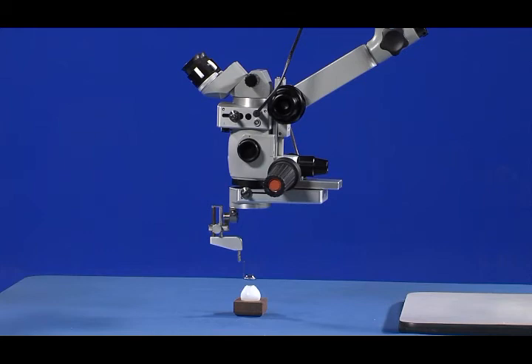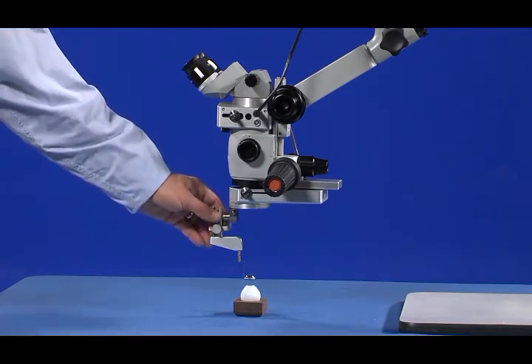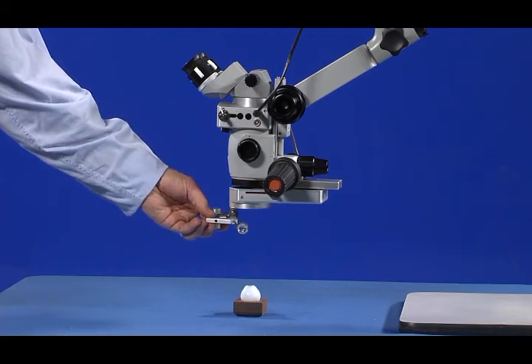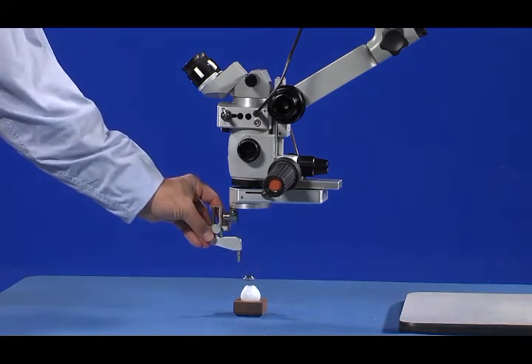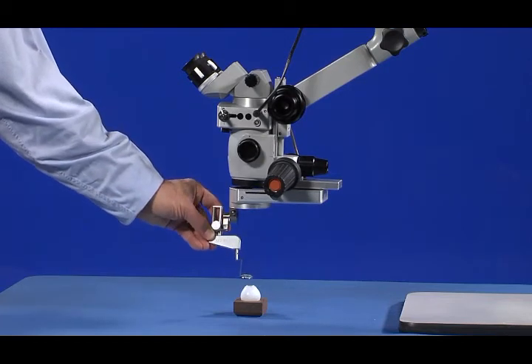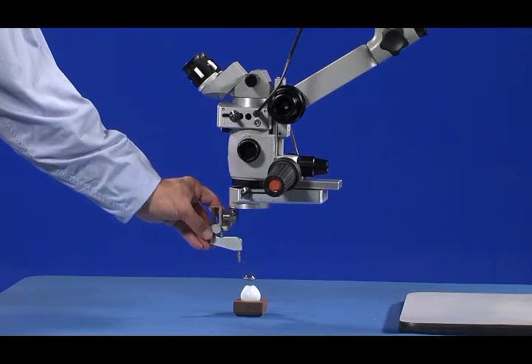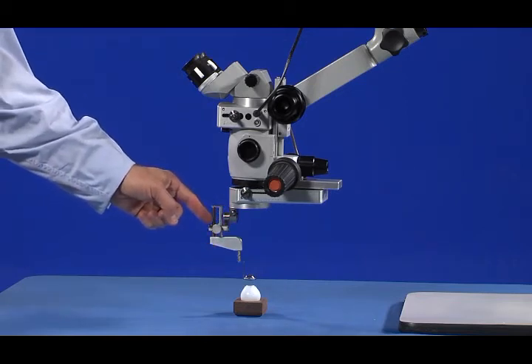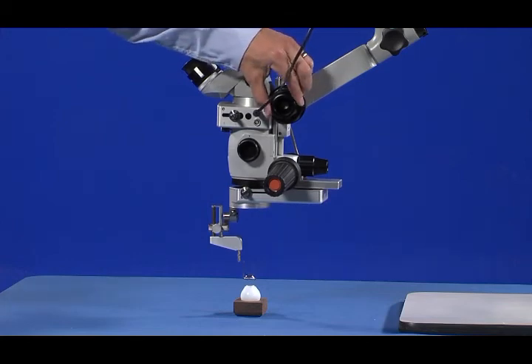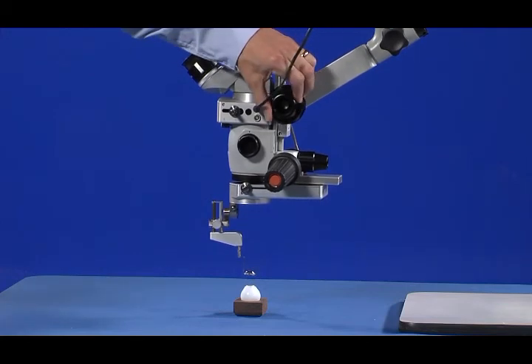Once you have completed the fifth step, no further adjustment is required. You can simply switch the LPU between its up and down positions as needed without adjusting the position of the microscope. It is important to remember two items when the LPU is in the down position and you are viewing the retina with the Merlin Surgical Lens: first, all focusing adjustments are made only with the LPU focusing wheel; second, adjusting the microscope height with its focusing pedal changes only the field of view of the Merlin Surgical Lens.